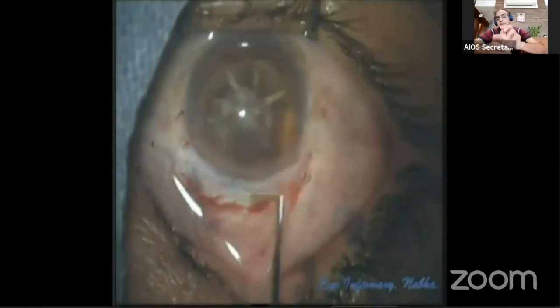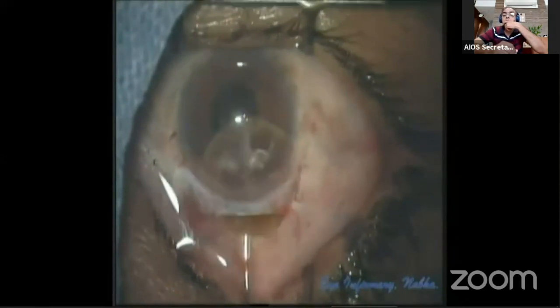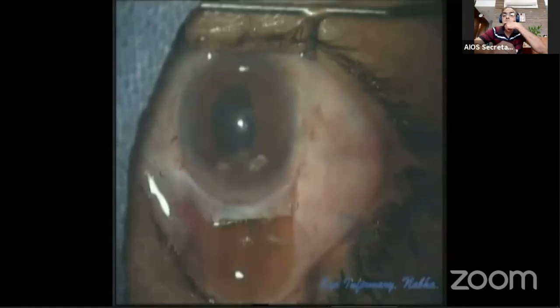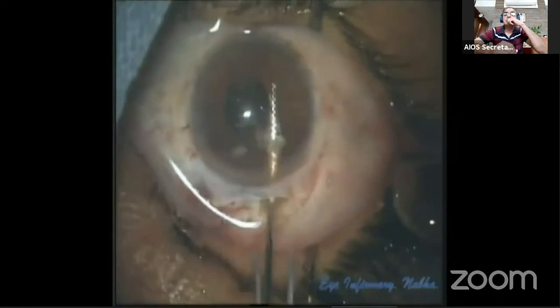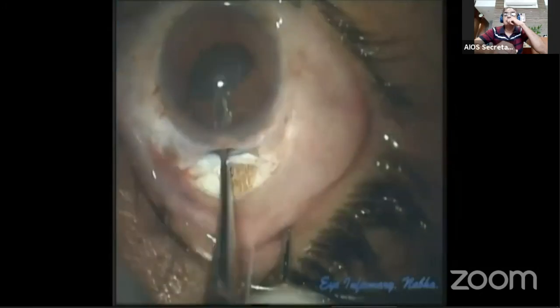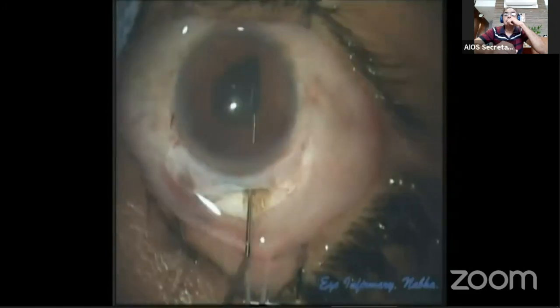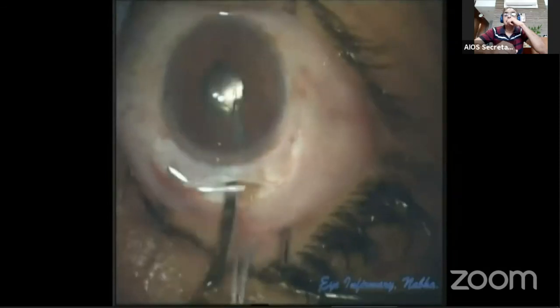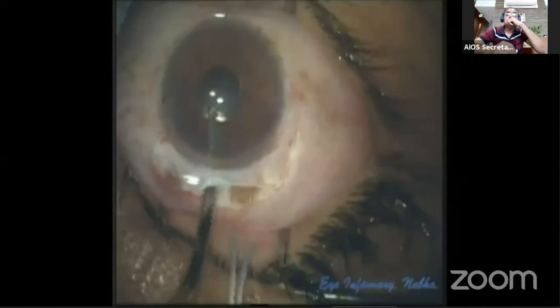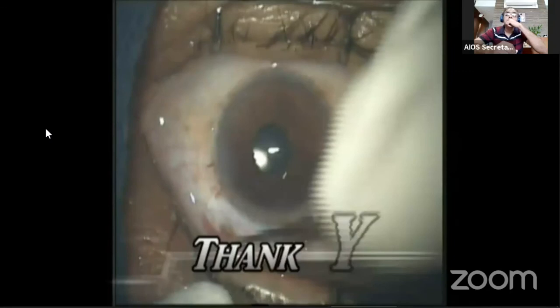The visco cannula is then withdrawn slowly, and during this procedure the lower lip of the corneal scleral tunnel is depressed to help engage and slowly visco-express the nucleus out of the AC. The key is how you flip the nucleus out of the bag — partially dislodge it and make it somersault around the cannula, like a gymnast using the rotary movement of their coach's arm during vault jumping. The buildup of pressure in the anterior chamber with visco, and depressing the lower lip of the tunnel, makes this a very safe, minimal tissue-handling procedure with very little repeated instrument entry into the AC.